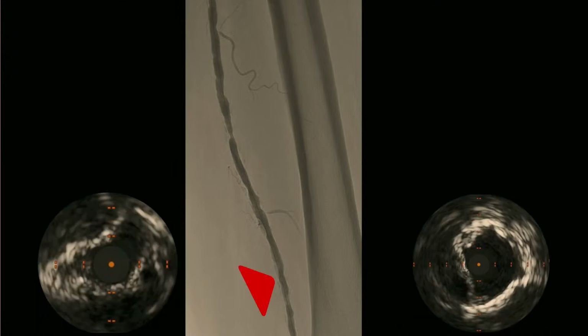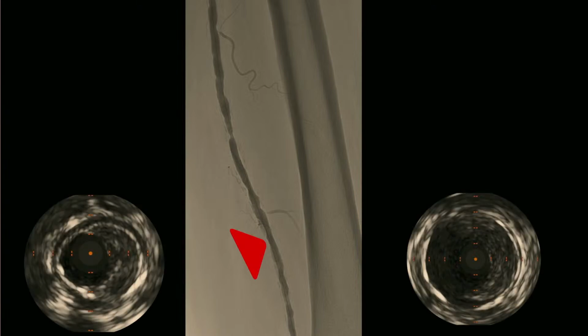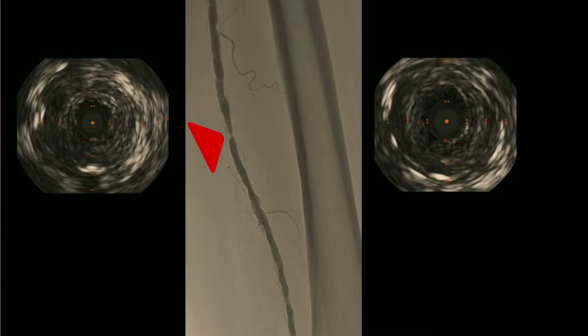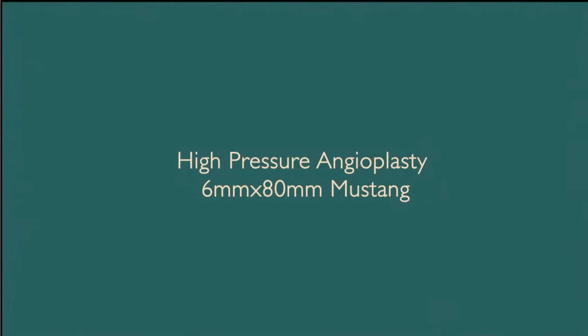If we now compare before and after with the IVUS pullback, you can see all of those areas where it was really crimped calcium. I've got at least 50% luminal gain. Further up the leg where the positive remodeling was, yes, there has been some luminal gain. But the lesion that didn't pop with the IVL, well, nothing happened. Of course it didn't happen.